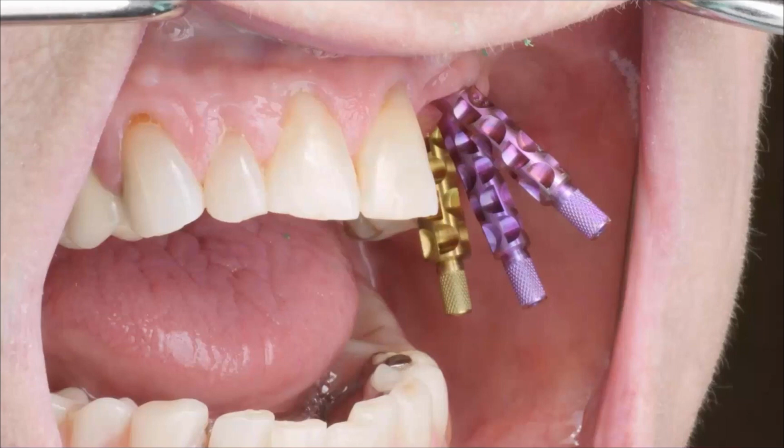Was it that you just looked and guessed, which when we're doing freehand implants is essentially what we're doing, or let's say you did it guided and you still had a malposition, then how did you come up with that guided implant position in the first place, right?